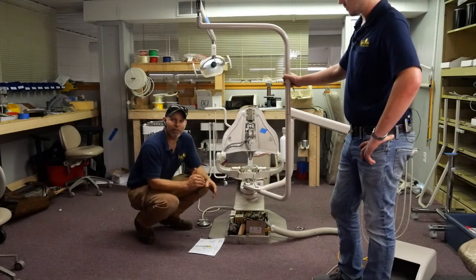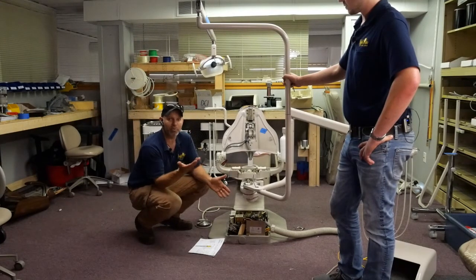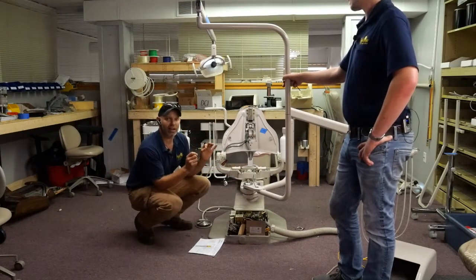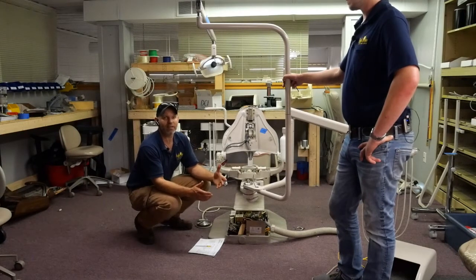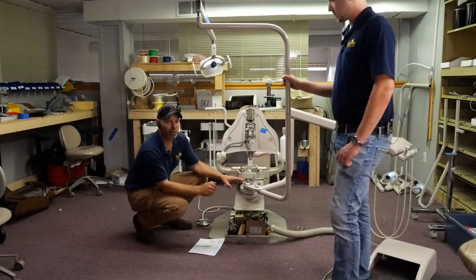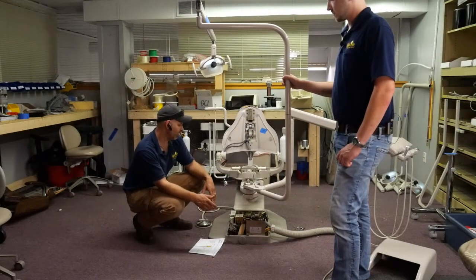The way that you know you have a problem with your hydraulic fluid is when the chair is in the extreme up position with the back up. Those are the two points in time where you've got the most oil inside your hydraulic cylinders. You'll end up with some sort of growling or really unhappy noise, and that's because your hydraulic reservoir has run out of oil, since it's all inside the cylinders. So this is a point in time where you might need to replenish that oil.